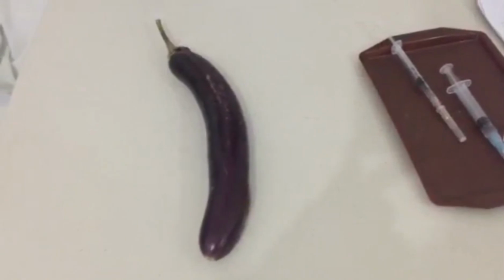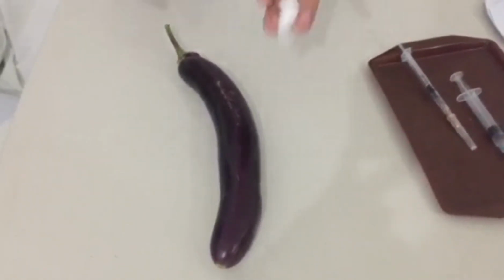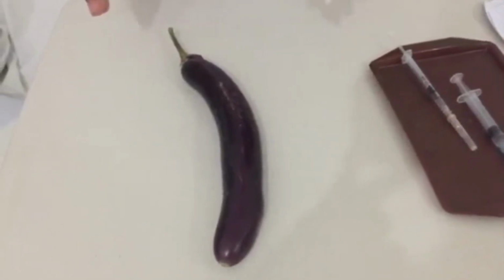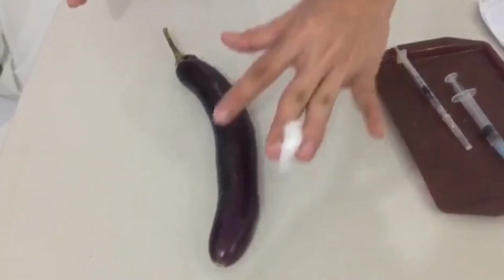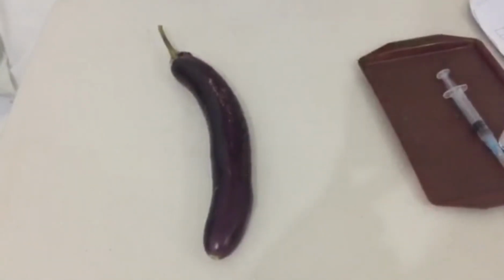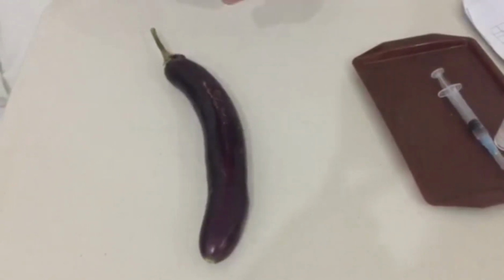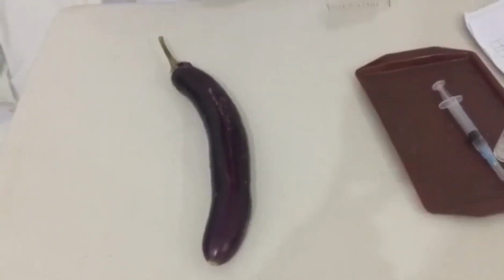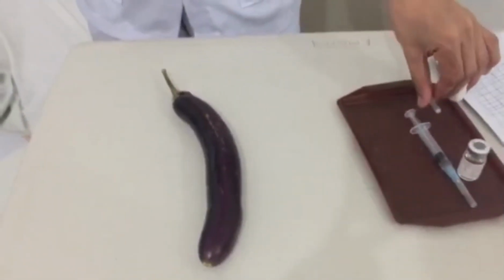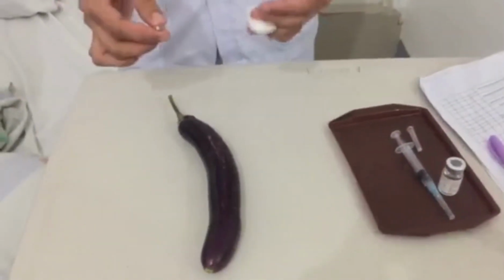Then place and hold the swab between the third and fourth finger of the non-dominant hand, or position the swab on the client's skin above the intended site. And then I will prepare the syringe for injection, and remove the needle cap while waiting for the antiseptic to dry. Pull the cap straight off to avoid contaminating the needle by the outside edge of the cap.